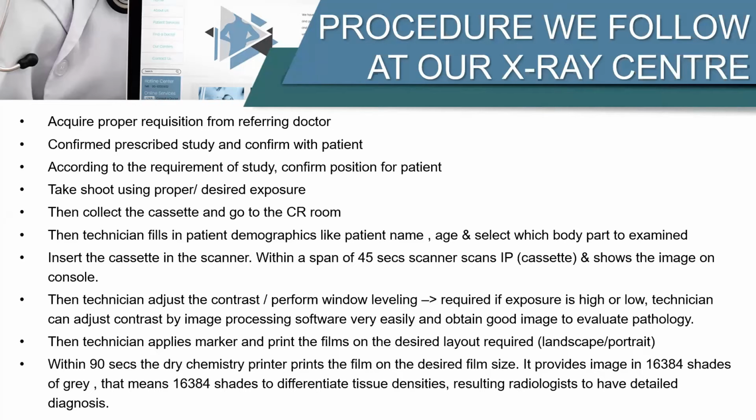Then the technician applies a marker, whether it is the left side or right side, and then after adjusting all the things, he gives a print which takes hardly 90 seconds to come out. So it takes very little time to develop an image. Next slide, please.